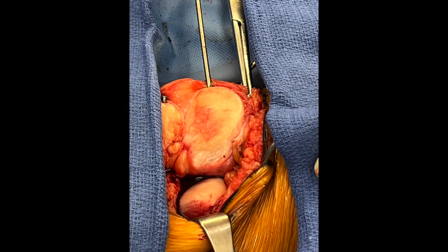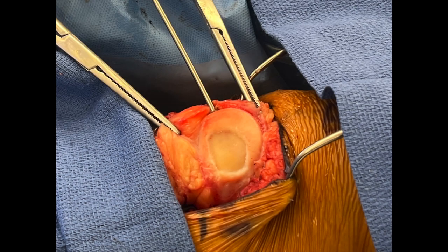Using ring curettes, any non-viable cartilage is resected back to stable margins. The calcified layer is removed with care not to violate the subchondral bone. Hemostasis can then be achieved at the subchondral region of the defect using thrombin-soaked gel foam.